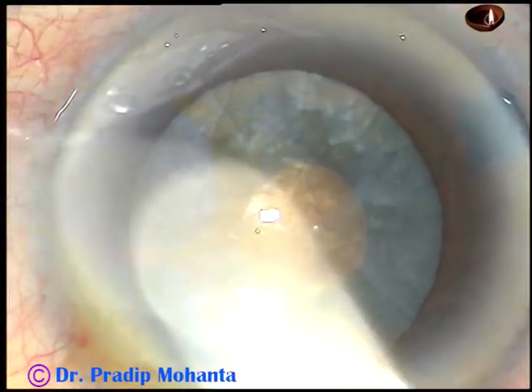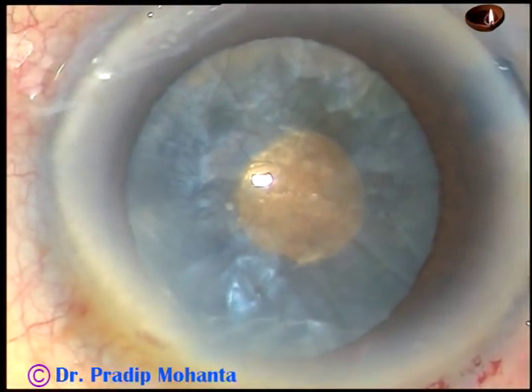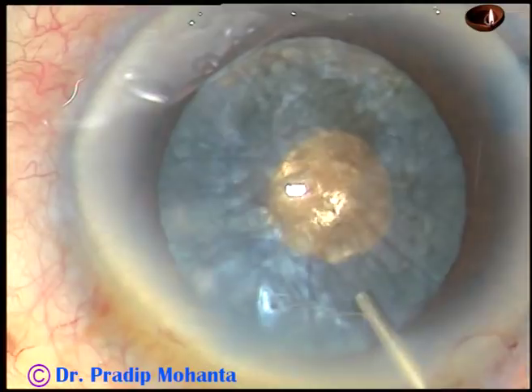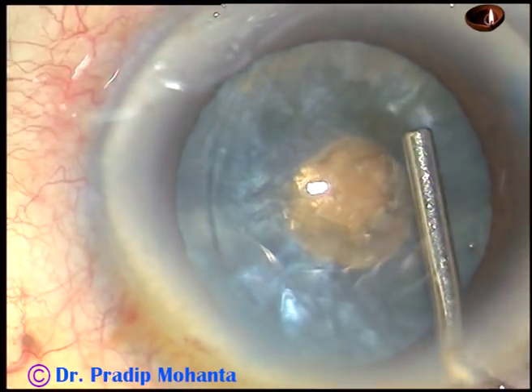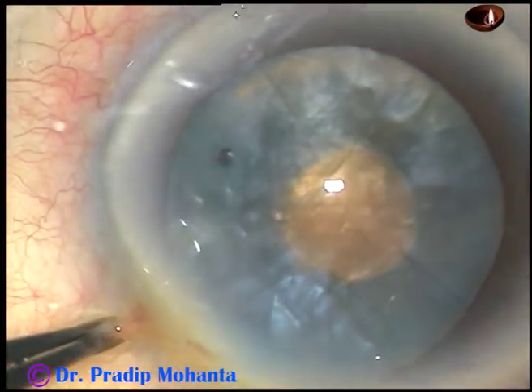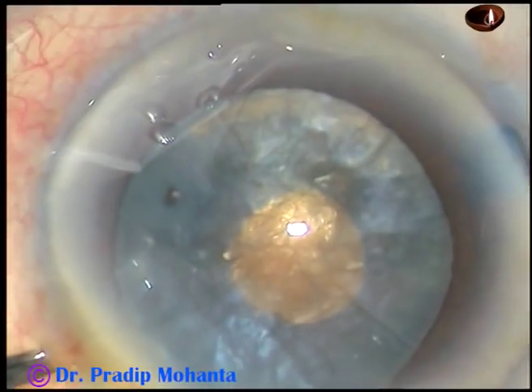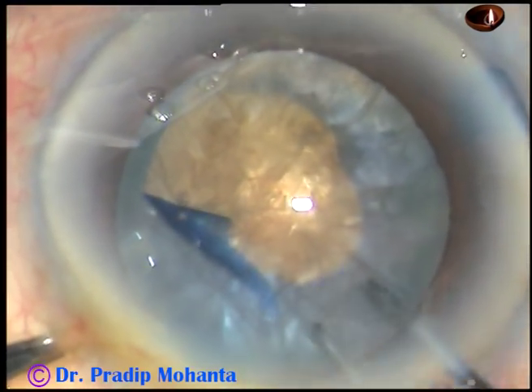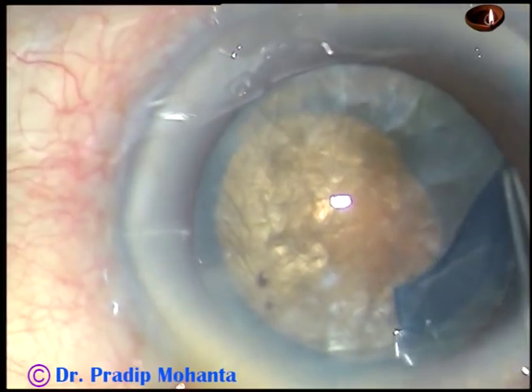Now I have added some viscoat. As I can see this nucleus is very hard, so I am using the modified soft shell technique. This is viscoat — a combination of chondroitin sulfate and sodium hyaluronate — and beneath this viscoat I am using HPMC. The chondroitin sulfate has gone upward and stuck to the corneal endothelium, giving better protection. Now I have made a nick and I am using the utrata forceps, doing a large rhexis because I saw that the nucleus is brown and hard.